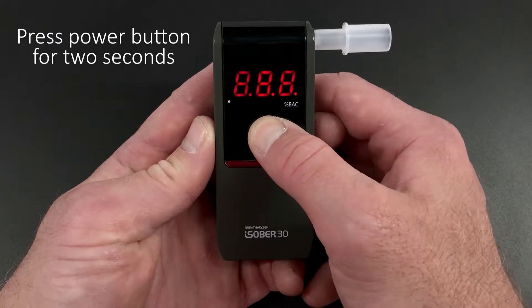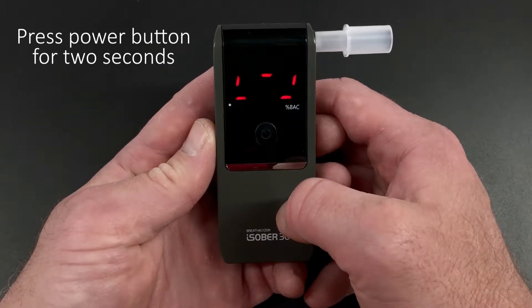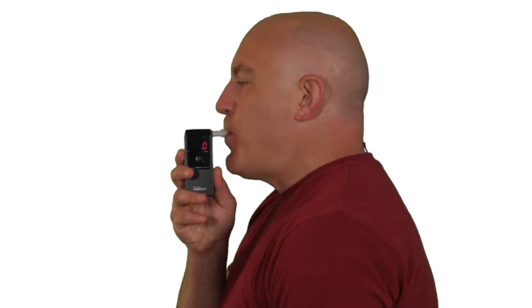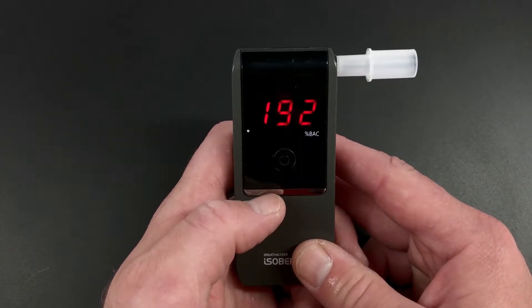To get started, press the power button for two seconds and the battery level will display. Wait until you can see the zero sign — this signifies that the unit is warming up. When zero appears, blow through the mouthpiece for four seconds until you hear a definite click sound. The result will be displayed for ten seconds and then turn off automatically.